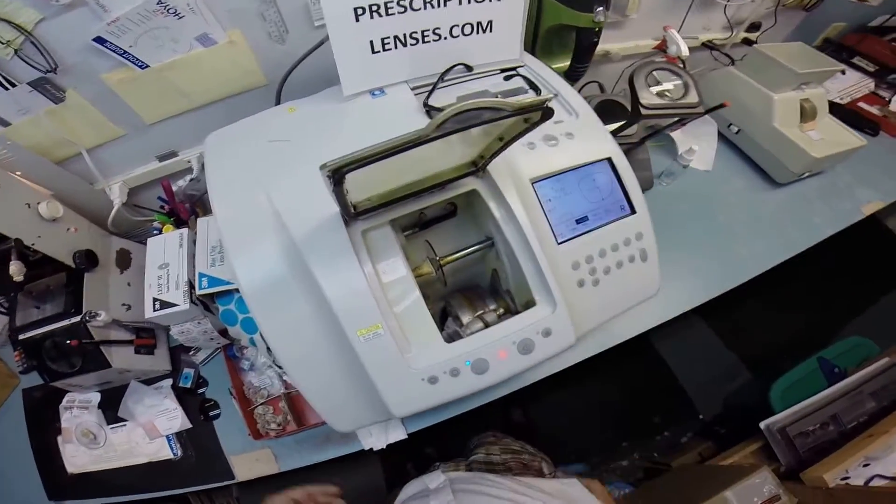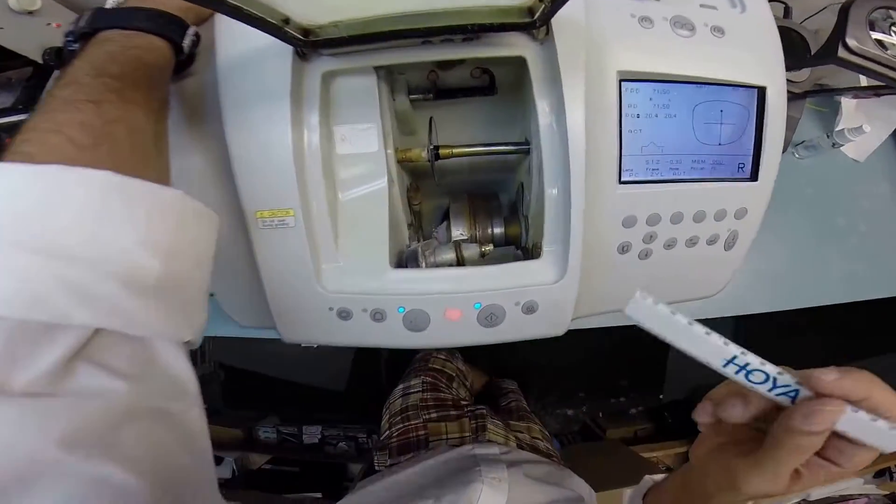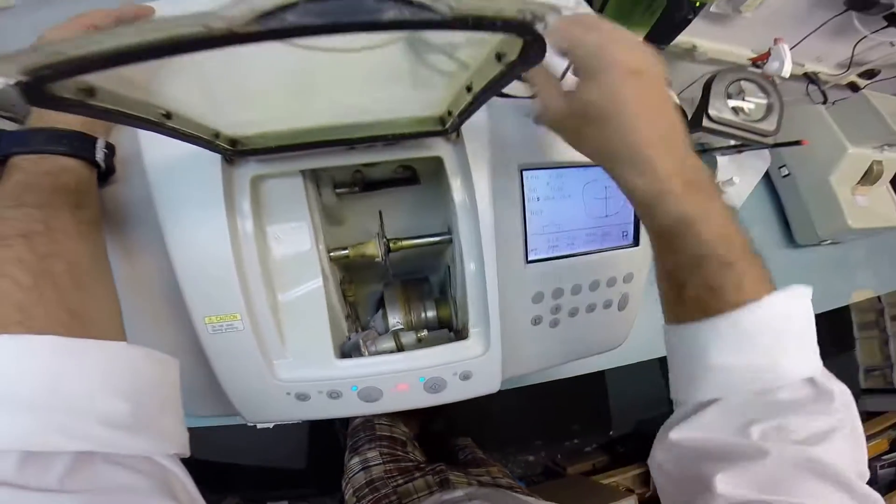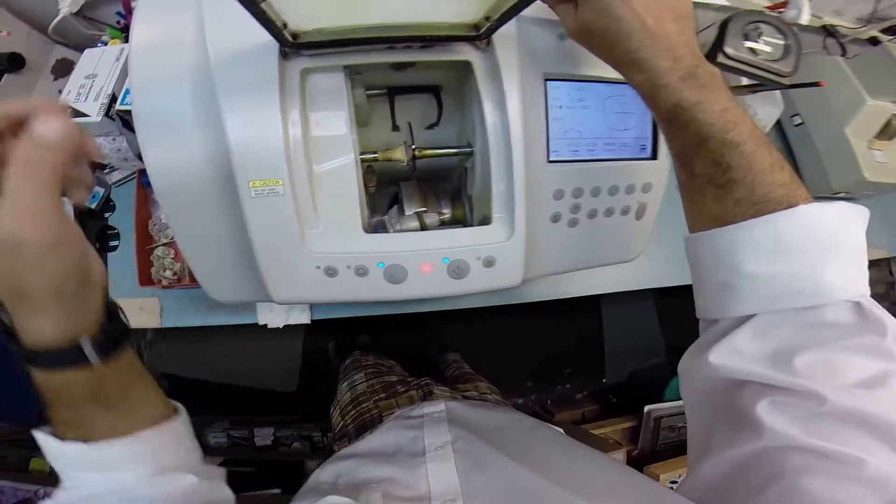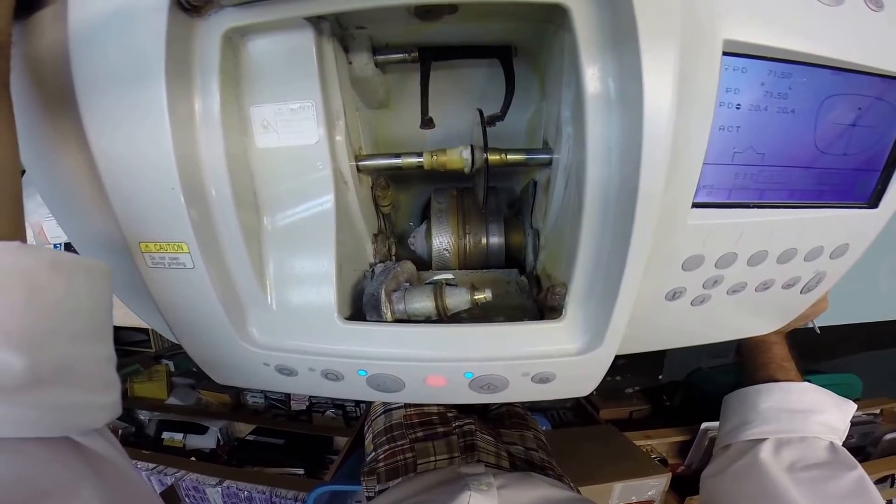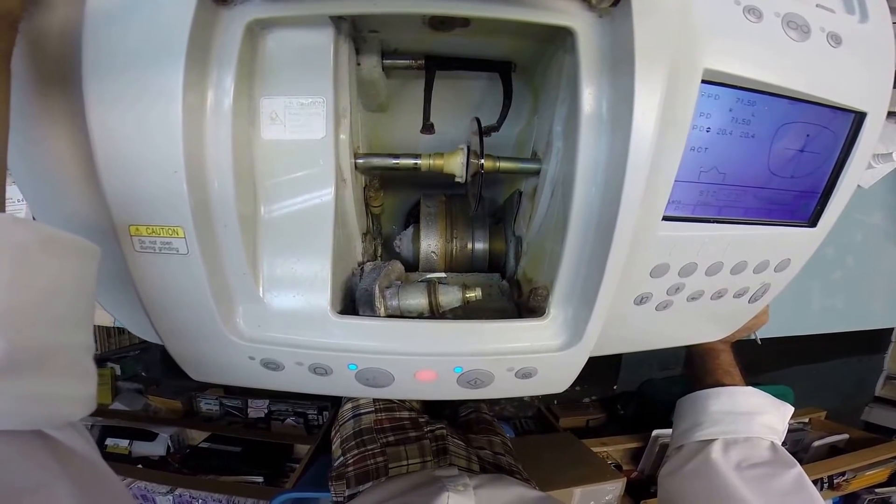Let's hit start. The first thing that's going to happen is these calipers are going to come down and trace the shape of the right side of the frame, starting with the rear surface - the concave surface which is closest to your eyelashes - and then it's going to move over and trace the front surface of the lens, also known as the convex side.